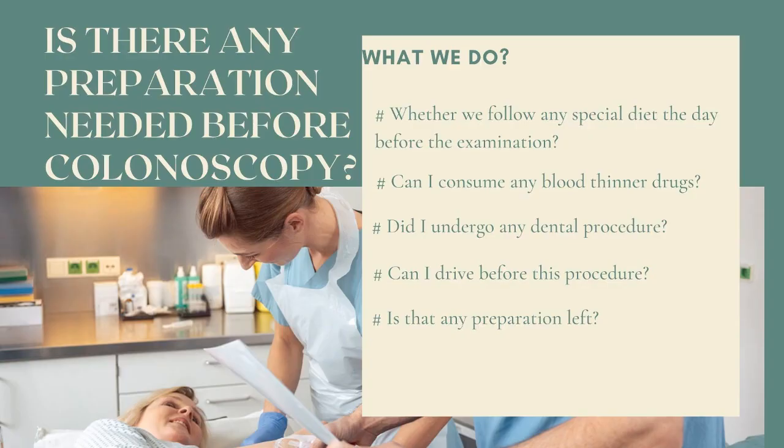Preparations needed before colonoscopy. Before the colonoscopy, there are some preparation procedures for patients who undergo colonoscopy. This process is known as bowel prep. Generally, solids must be emptied from the gastrointestinal tract. Patients follow a special diet the day before the exam; they don't eat any solid foods, and have a liquid diet for 1 to 3 days before the colonoscopy.